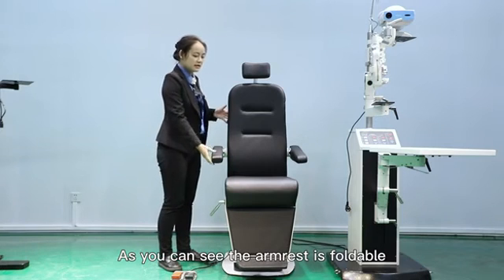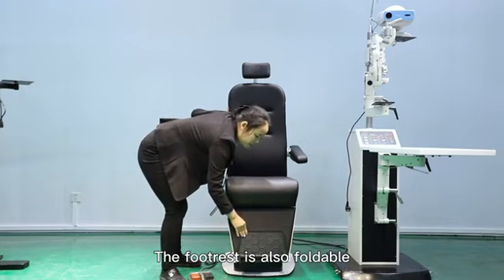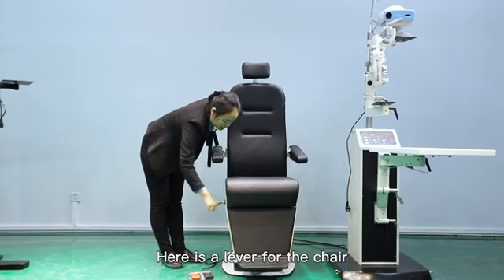As you can see, the armrest is foldable. The footrest is also foldable. Here is a lever for the chair.